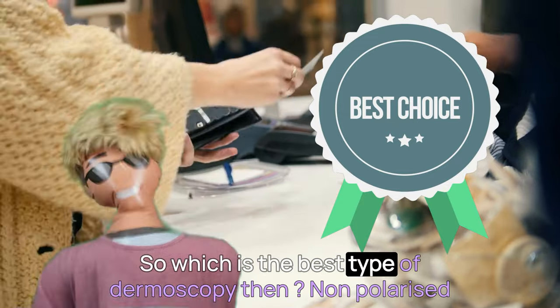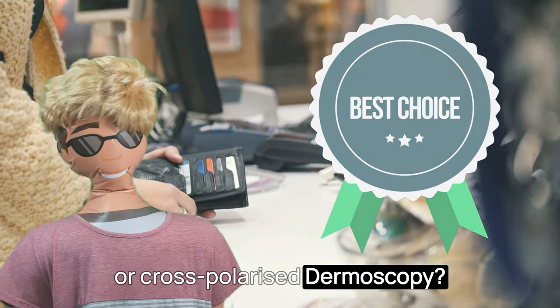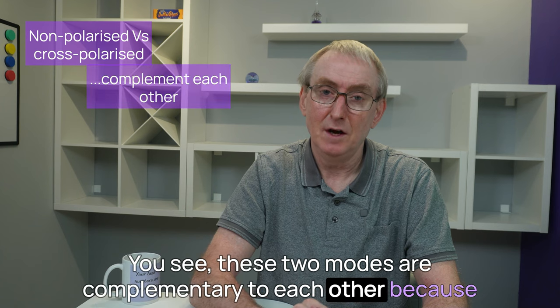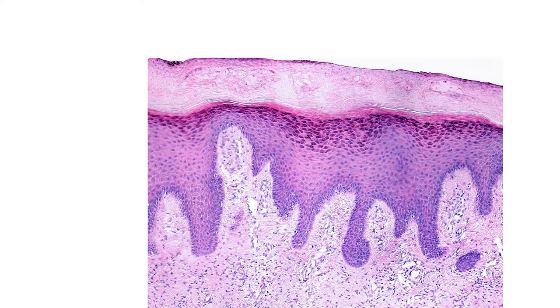Well, actually Dave, it's neither. You see, these two modes are complementary to each other because they see at different levels within the skin. Let me show you.